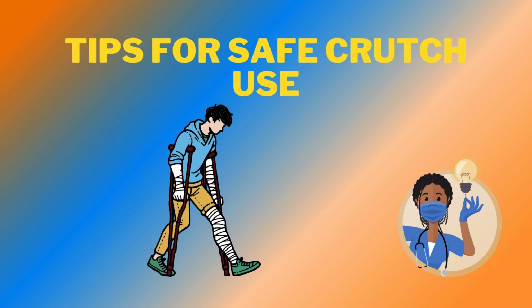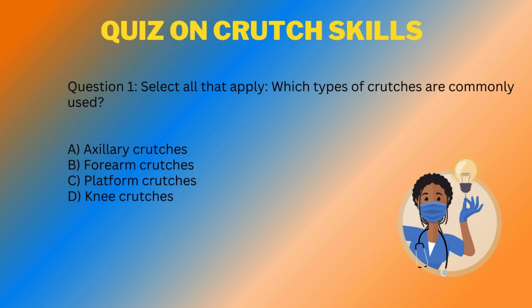To ensure safety, always wear appropriate footwear. Keep the crutch tips dry and free of debris. Avoid placing weight on the armpits to prevent nerve damage. Take small, manageable steps. Now let's answer this 5-question quiz to test our knowledge.